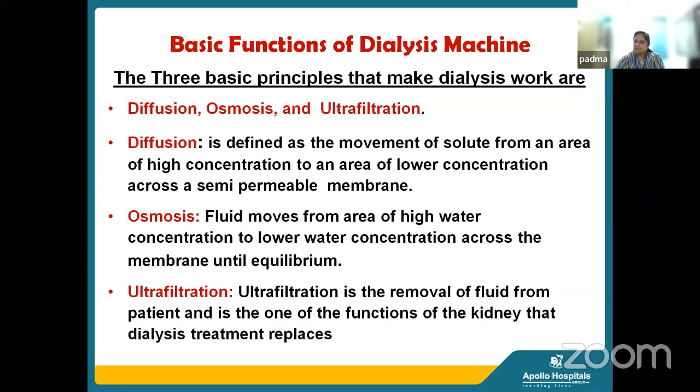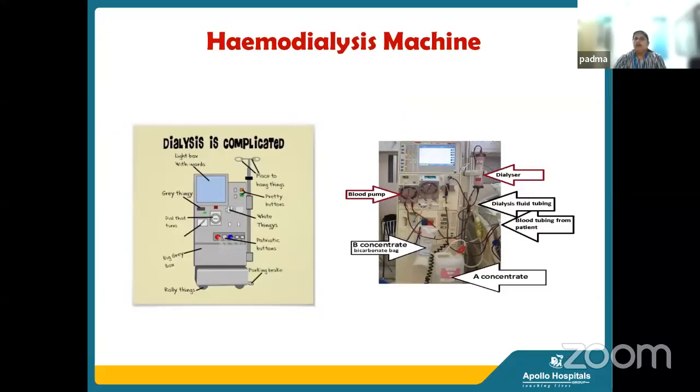And these are the hemodialysis machines. These are the panels and functions of the dialysis machine, and these are the tubings connected to the patient.